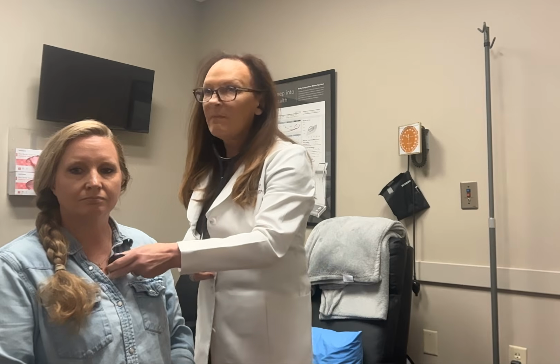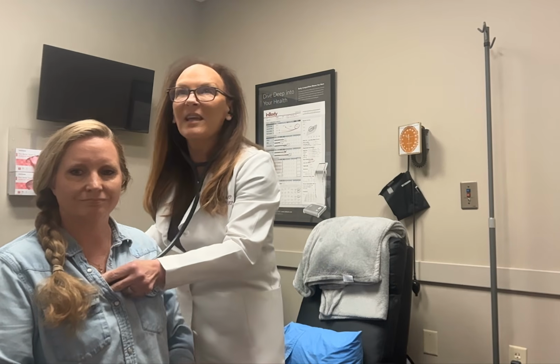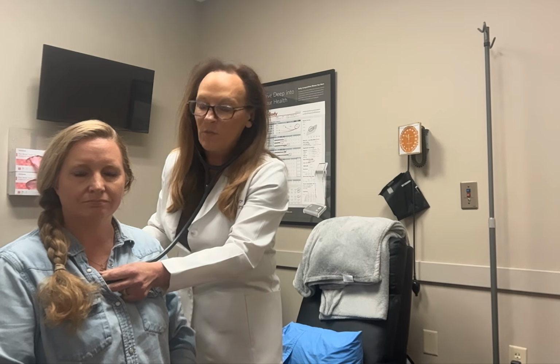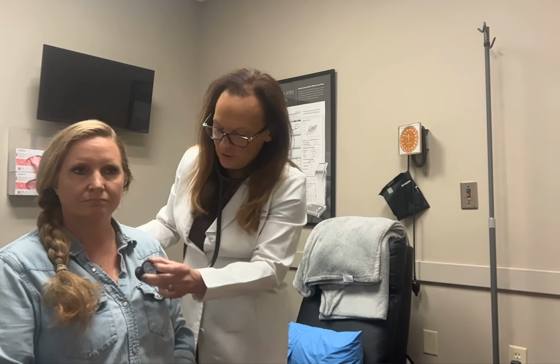We're going to next assess the heart, anterior and posterior chest. Using the bell and diaphragm, we're going to check the aortic, which is the second intercostal space on the right sternal border. We're going to check the pulmonic, second intercostal space on the left sternal border. We're going to check Erb's point, which is third intercostal space on the left sternal border.